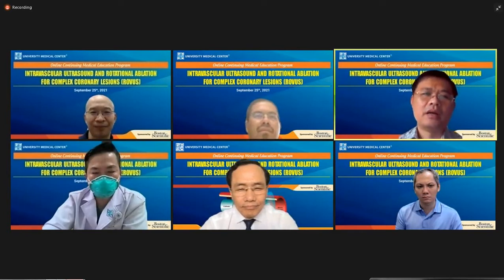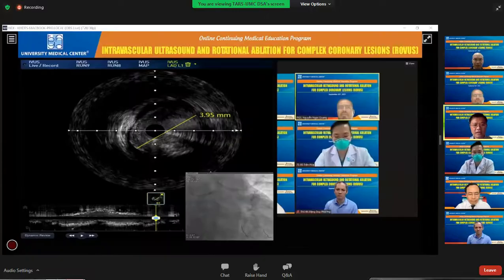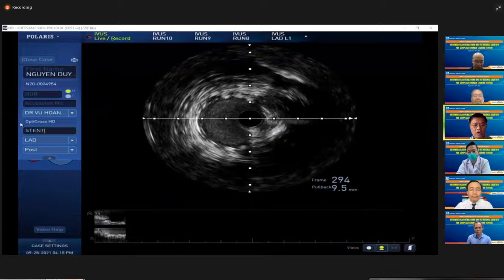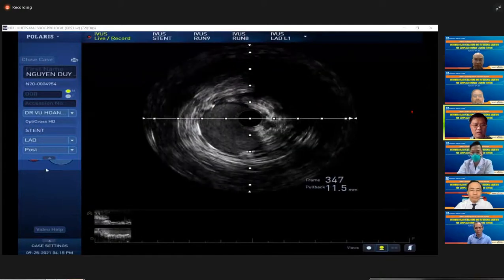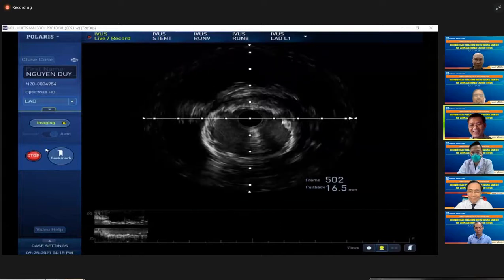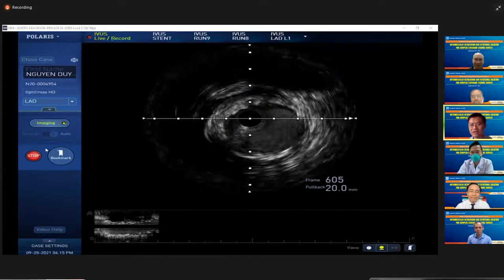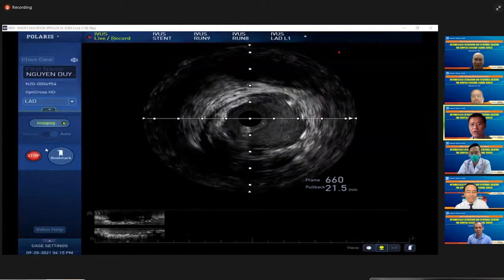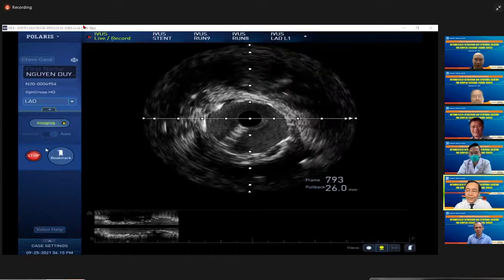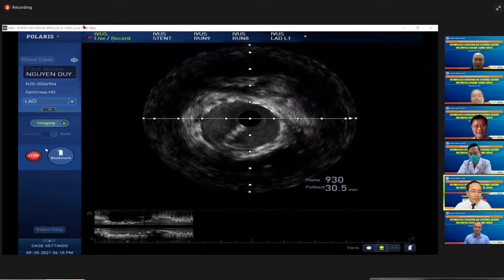So in this case, Dr. Wu, maybe it's a true dedicated technique. And today we want to show the IVUS in complete PCI. So in this situation, Dr. Wu should show the technique to everyone to know about this. I think so. Thank you, Dr. Tân.